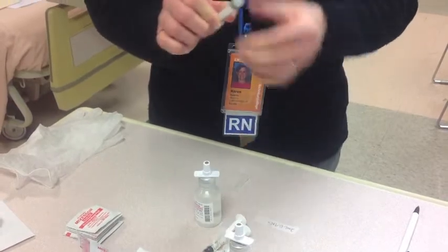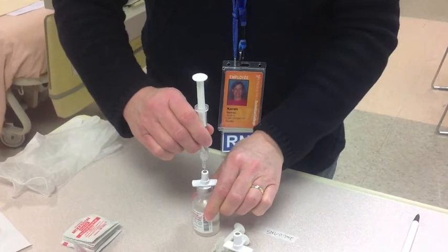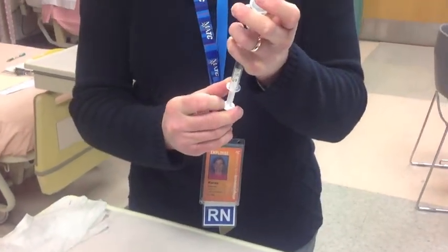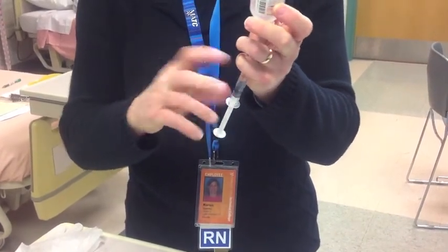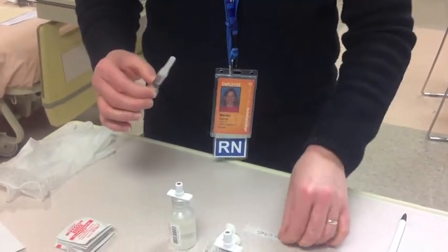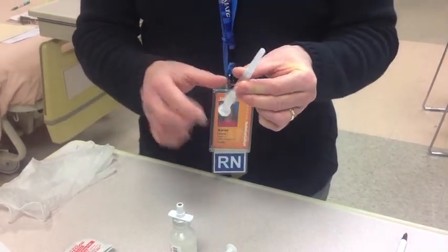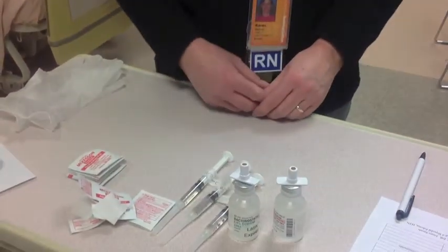I'm going to draw up 2 mLs of air. Put the air in the vial, air to air. Draw up my 2 milliliters of saline. And then I'm going to label my saline with the tape that I've prepared earlier. Okay, now I'm ready to do my 3rd check.